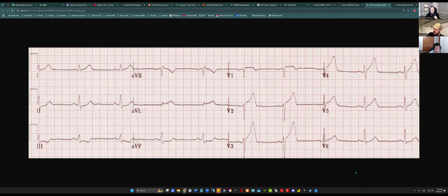Show me which laterals. Lead one. Oh yep, it's there, just very slightly, right? Would you say that's elevated? Because it looks elevated to me. I just started top left and started working my way through it. Very mild.